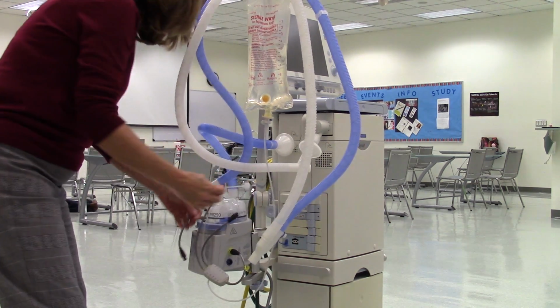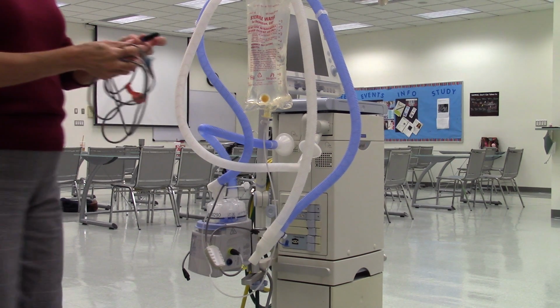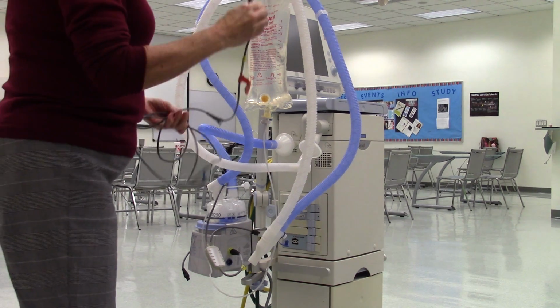You just let it hang here for a second. And then the inspiratory cable, it's a little bit easier to see the arrows because they're bright white, and then I can line it up with those arrows. And I just push straight in.